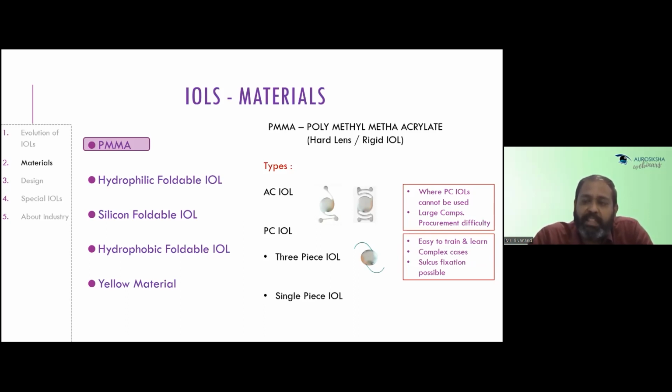They are used in complex cases, and they're also used for sulcus fixation. But again, this is also a product that is almost on its way out. There are very few manufacturers who are still manufacturing this product. Single-piece lenses have become the norm for a very long period of time on the PMMA platform.